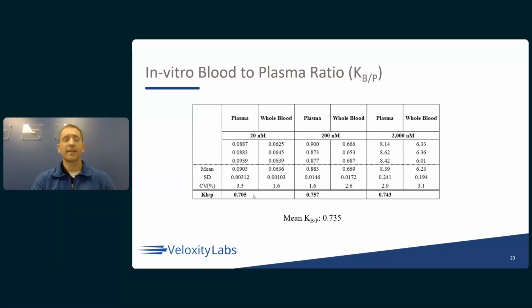That's not always the case. There are examples like sirolimus. 95% of it will go into the blood, so you won't really see much in the plasma at all. So if you are going to sample plasma, this is something that's important to do no matter what. But even if you're going to do something like this where you move from plasma to blood, it's important to understand how those exposures are going to scale based on what compartment you're looking at.